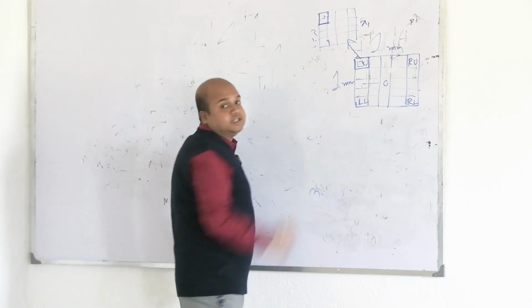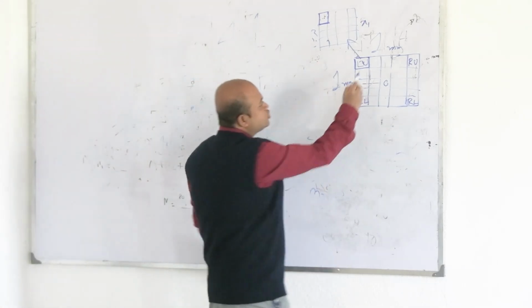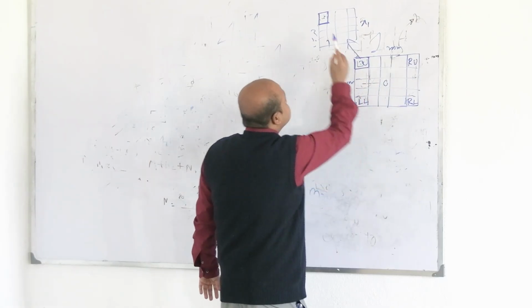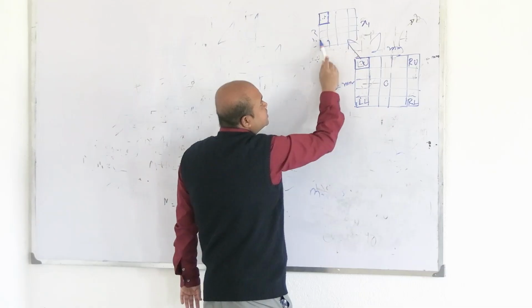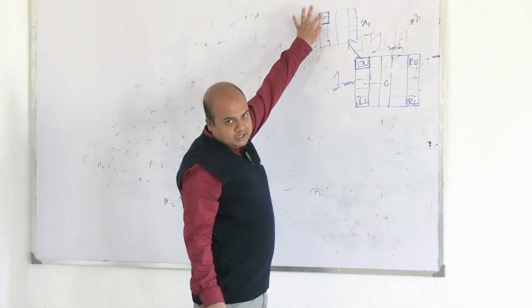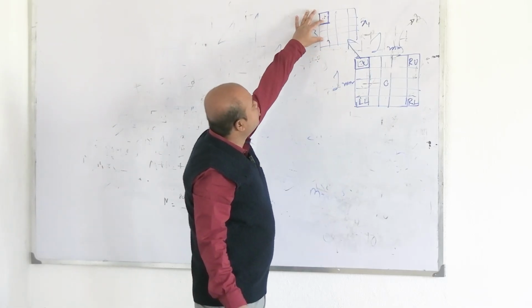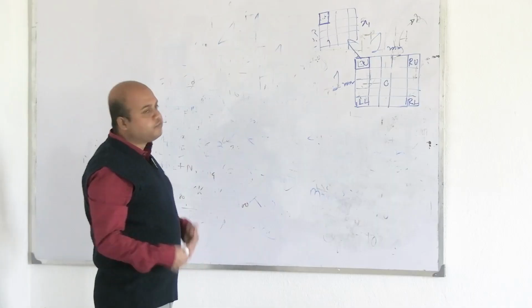Now, suppose I count this cell. Conventionally, we do it from left upper to others. In case of this one, we will go from left upper, right upper like this, 5 squares. In case of counting this 16, we will count 1, 2, 3, 4, 5, 6, 7, 8 like this up to 16 squares. So, we conventionally start from left upper, but we can start anywhere. We have to count all these squares. That I have to remember, so as not to confuse ourselves.